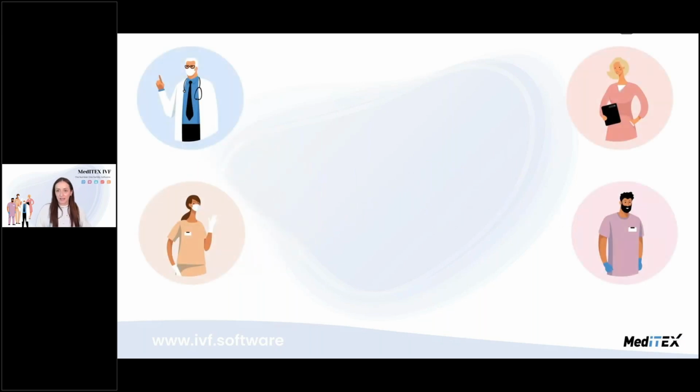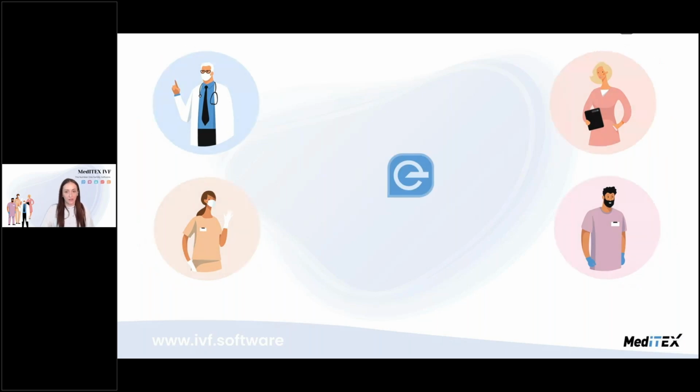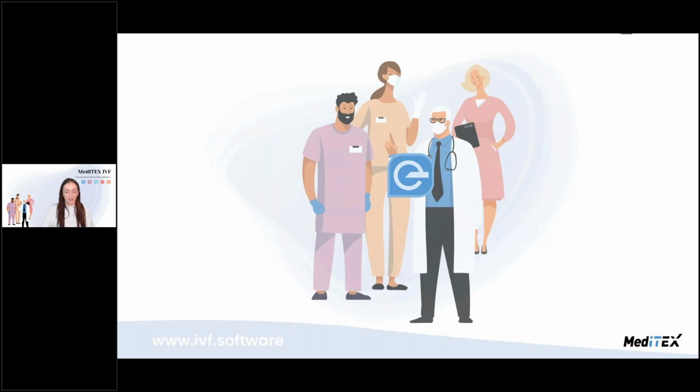There's a last thing that I would like to mention. We have seen in our recent case study interview with one of our clients from South Africa, and also something that many of our customers experience, is that MedITEX IVF does way more than just support individual tasks. MedITEX IVF basically puts the tasks together. It connects people. It brings embryologists, nurses, clinicians, and the management onto the same page. You can share access to data and seamless workflows, and MedITEX IVF turns departments into a team.